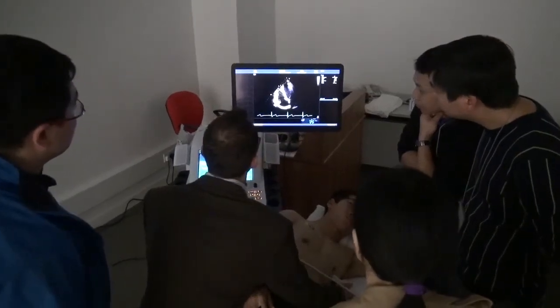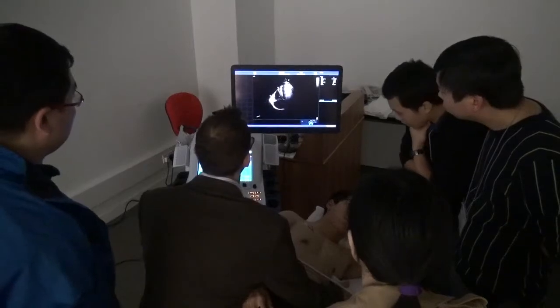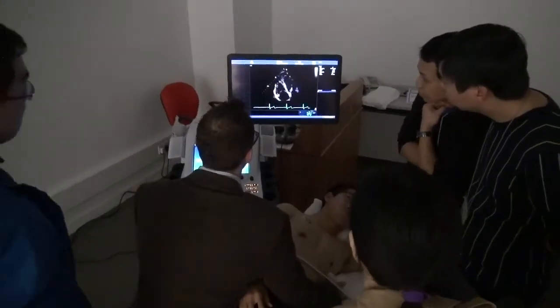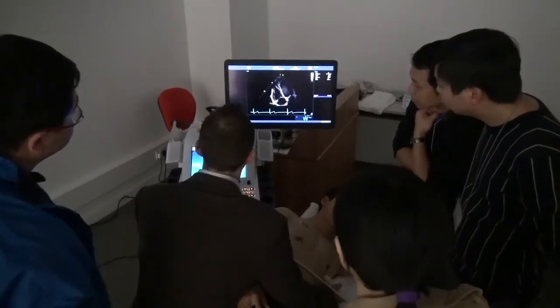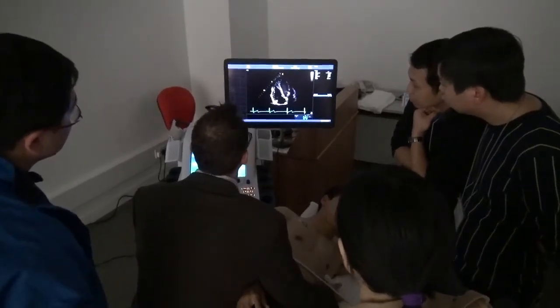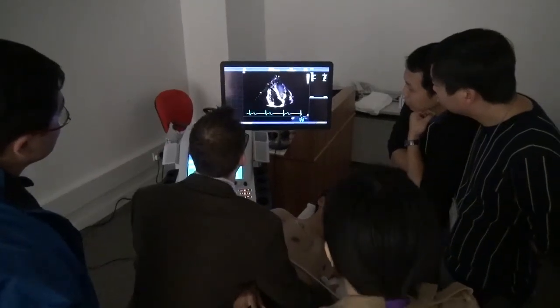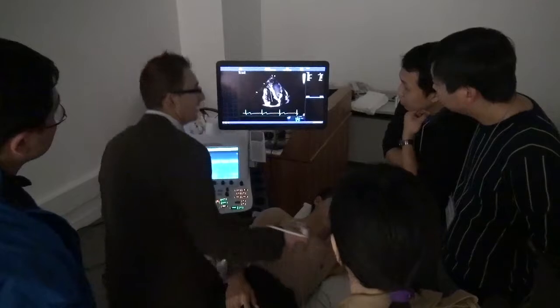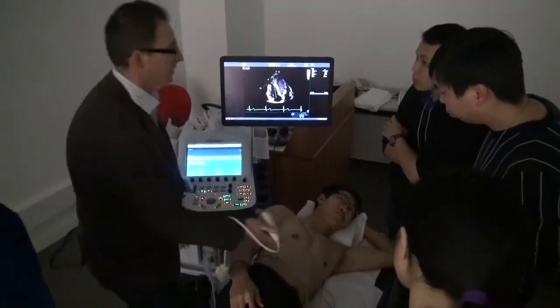Any length from here to here. In the 74. If I move down a bit to this, if you measure it, right, I'm fully on the apex there. Not as clear, but look at the length of the first. If I now measure it from the apex. Okay, so it literally is 2 centimetres difference, and that's because I'm truly on the apex.